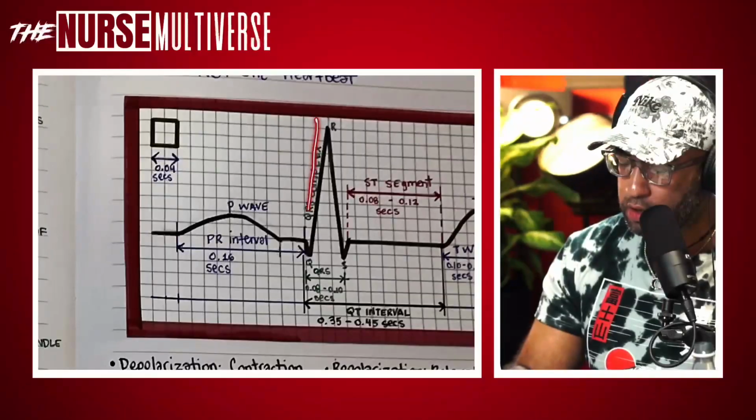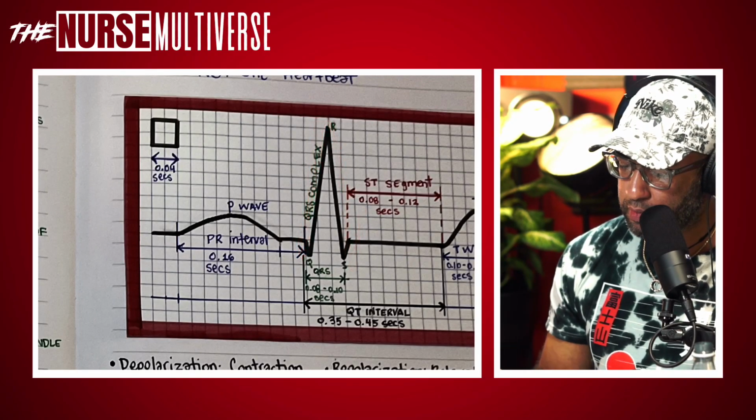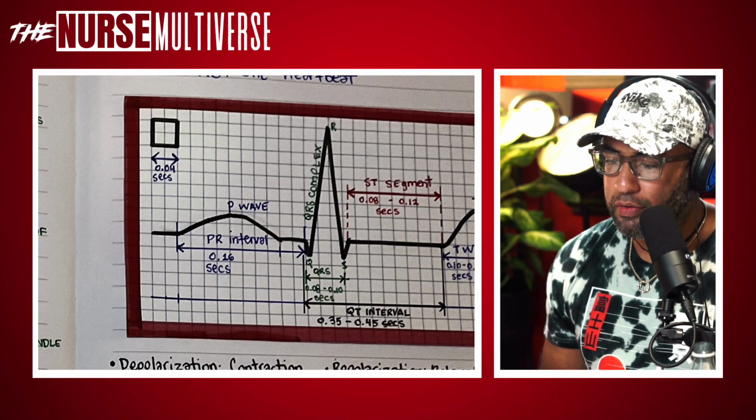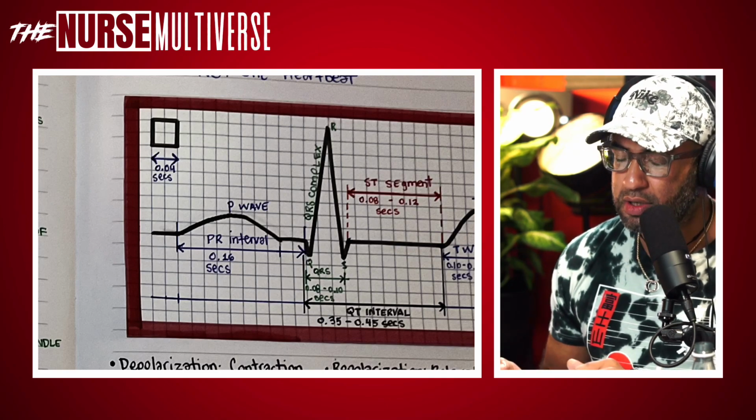So this is the way one heartbeat looks. We have the P wave, the QRS complex, and the T wave. There's another wave called the U wave, but I'm not going to cover that because I just want to cover something simple. At some point in the future, we're going to be looking at arrhythmias. Today, I'm going to do arrhythmias, but very lightly. I'm just going to focus on what happens in one heartbeat.